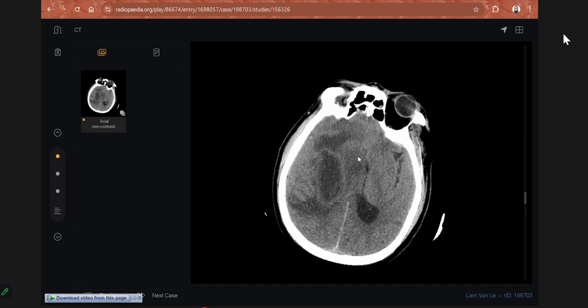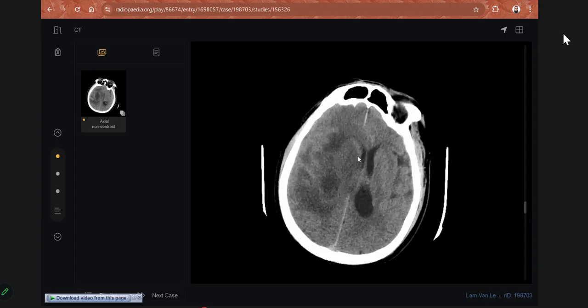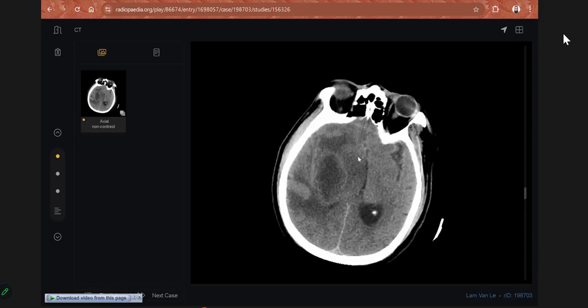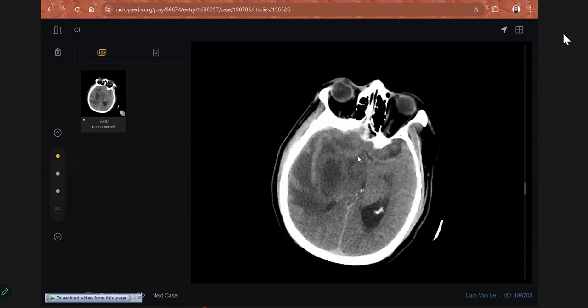The third thing is the history that favors it, and also the enhancement pattern of the abscess is such that the medial wall is usually thin and the lateral wall is more thick as compared to the medial wall. In mets, there will be a thick, nodular, irregular wall enhancement, peripheral. They can have peripheral enhancement, yes.